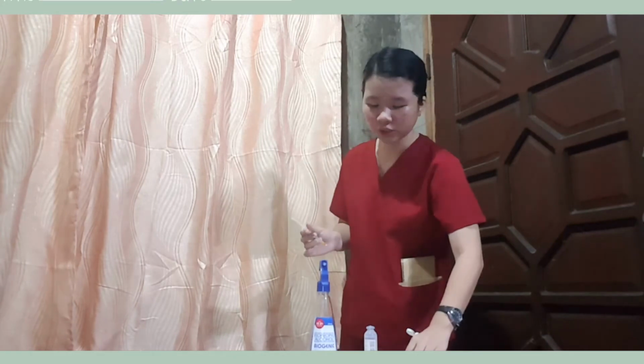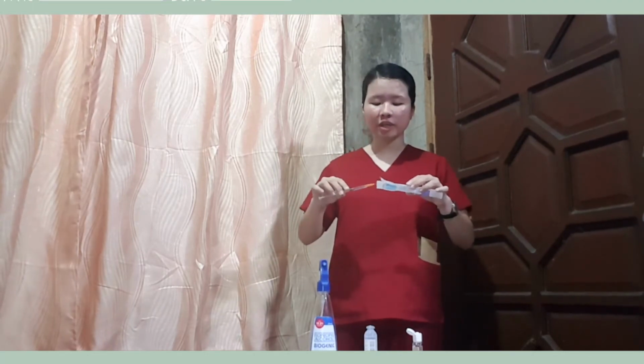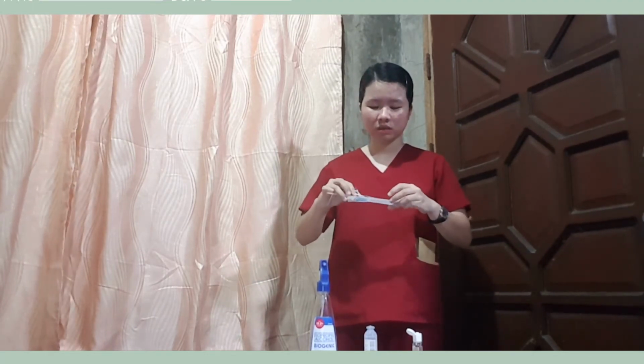And now we're going to proceed to procedure number 15, which is to recap the needle and place the insulin syringe on top of the medication ticket. This is to avoid contaminating the medication.